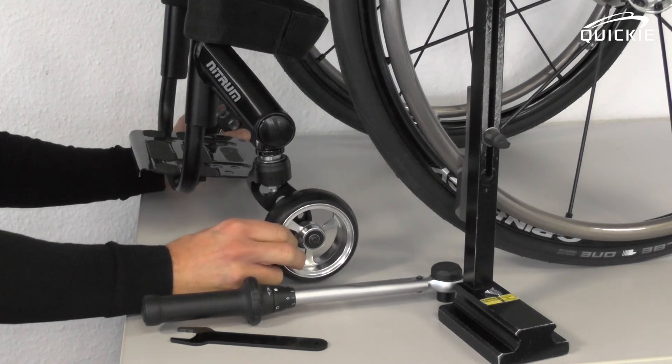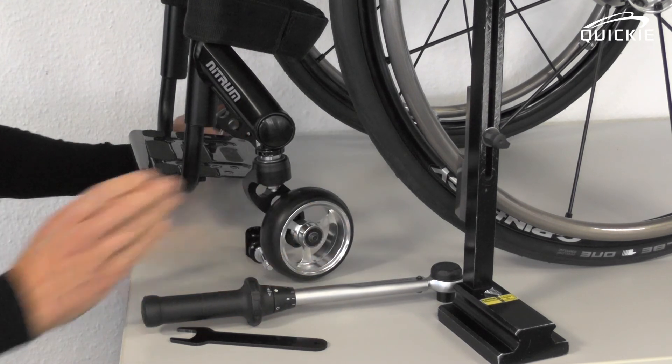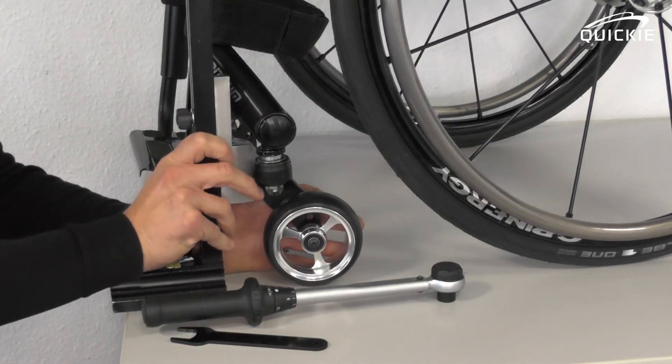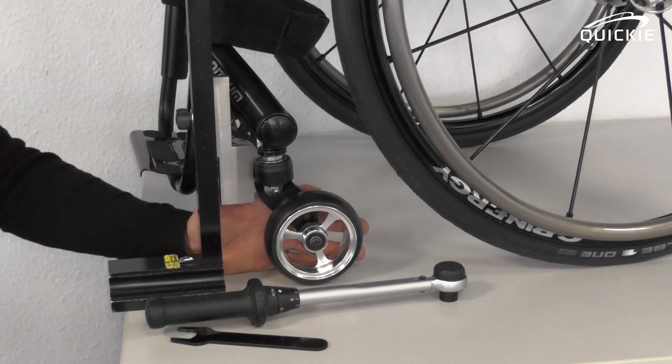You can see that all caster wheels touch the ground and the chair won't veer to one side again. After having done this procedure, you might want to check the caster fork angle again, because in many cases you need to readjust the caster fork angle as well. This procedure can be found in another video.